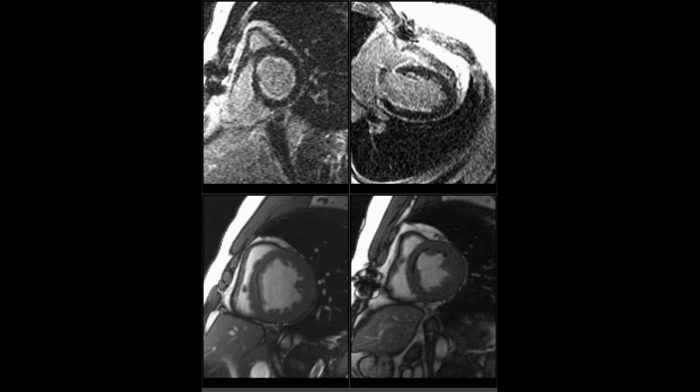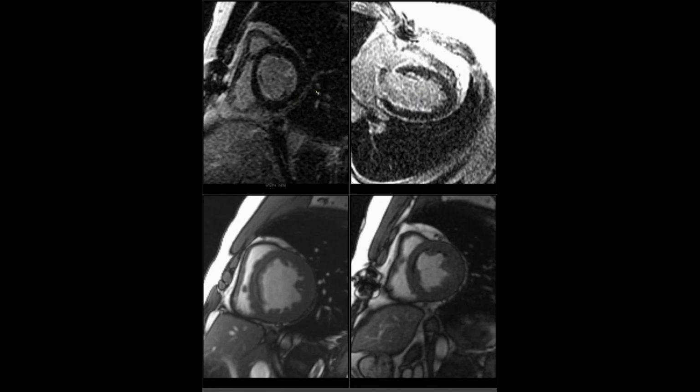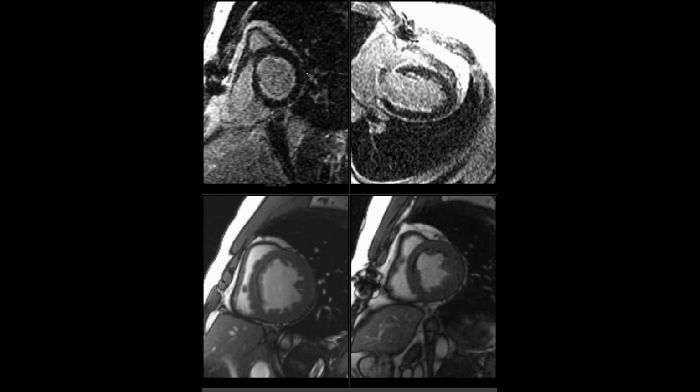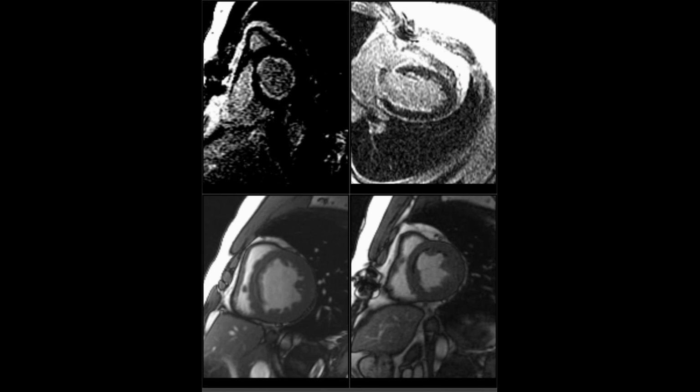Oh, no, I'm here. I was just zoned out looking at another clinical case. You're talking about subendocardial enhancement and hypoplastic heart? Yeah, hypoplastic left heart syndrome repaired in infancy. Wondering if this could be endocardial fibroelastosis. Yeah, I don't know. I would have to look it up. I mean, the enhancement pattern would fit. I don't know if I've ever seen a case. Okay. Well, that's that one. Otherwise, still kind of a mystery.